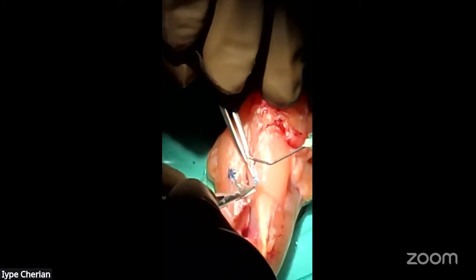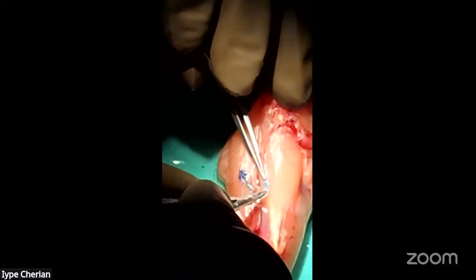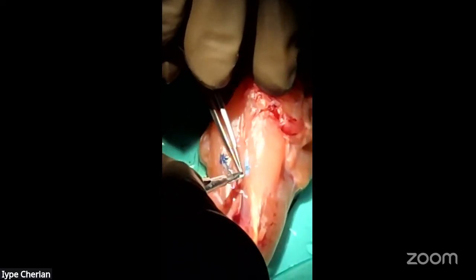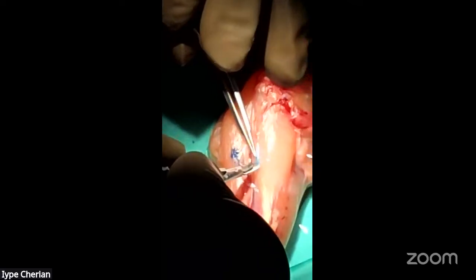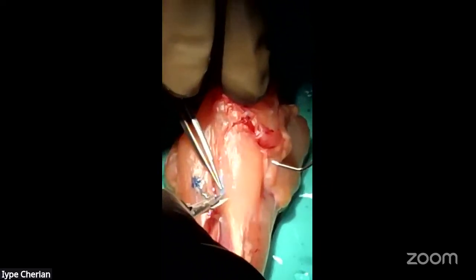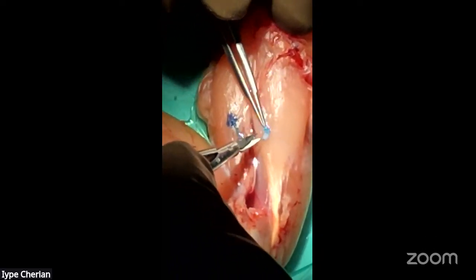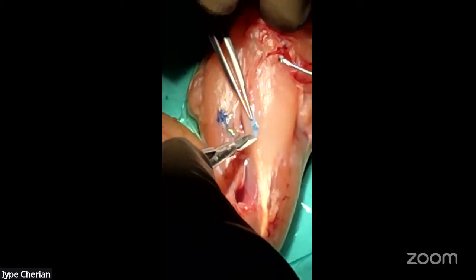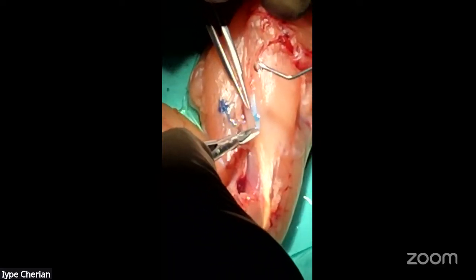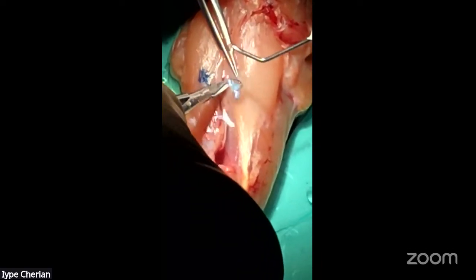Right. So the patch repair is almost done. Vikrant, you can come here for a minute, Vikrant. Can you give me a suture?